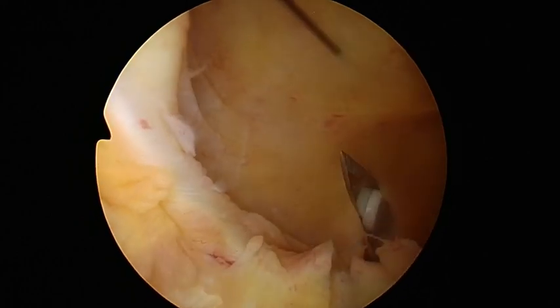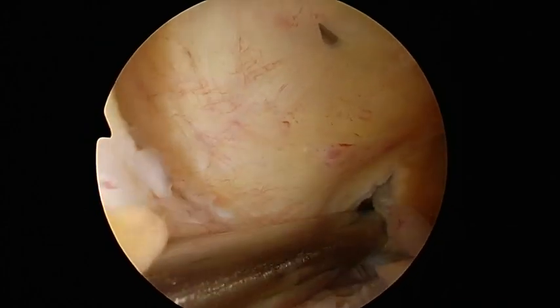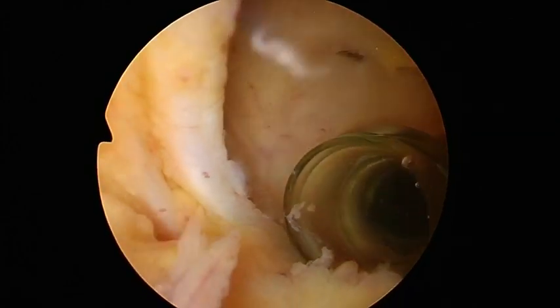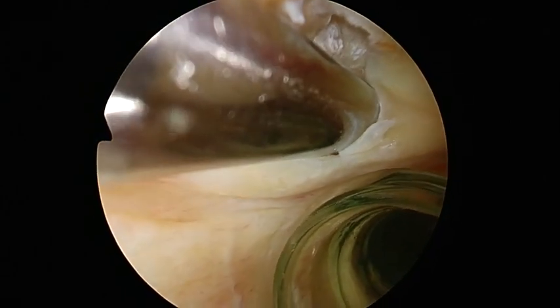The skin and joint capsule are incised with the scalpel, and the cannula is inserted into the low posteromedial portal. The arthroscope is then introduced through the high posteromedial portal using a switching rod.